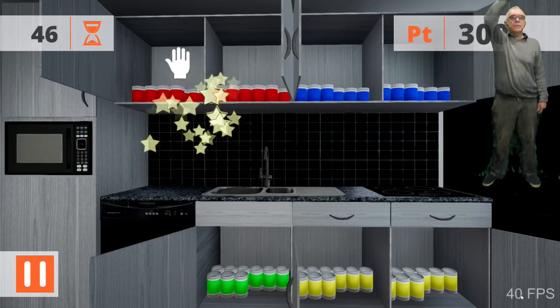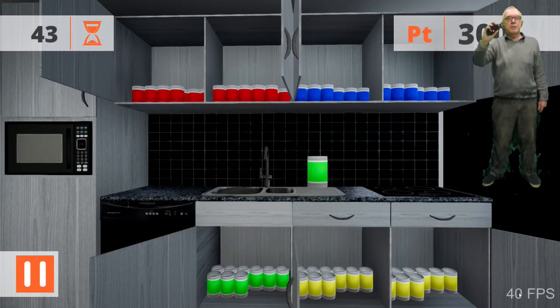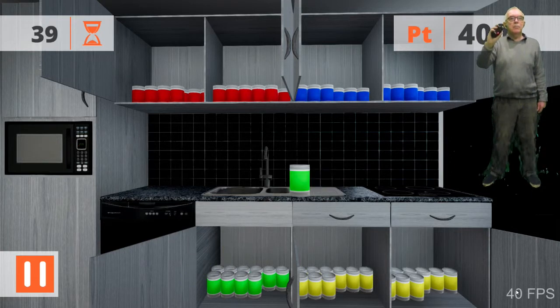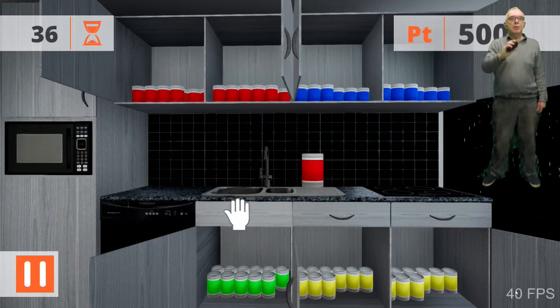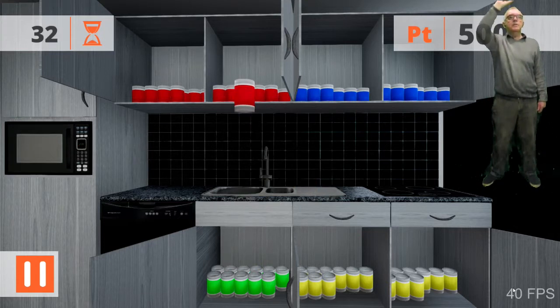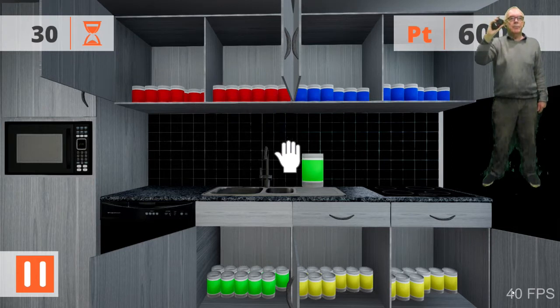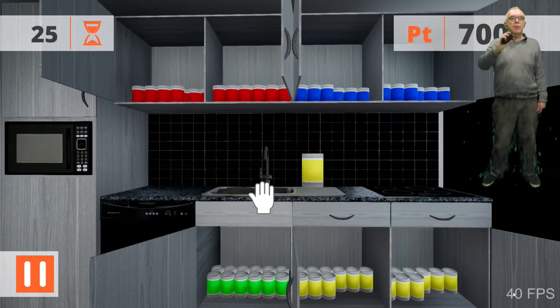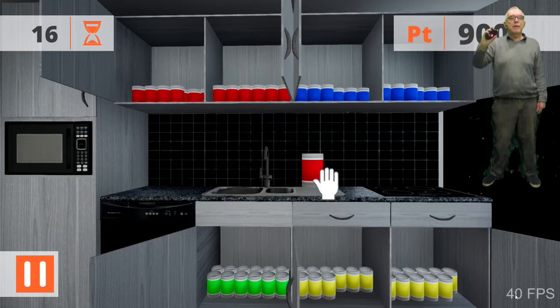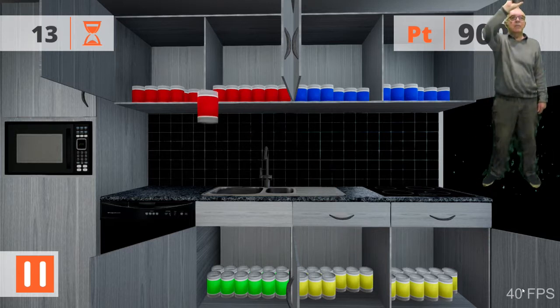And with practice, you can get quite quick at this. Green can goes down there. So it's testing not only your physical movement, but also some of your reaction times and your cognitive capabilities. If you're working with patients who have restricted mobility, you do have the option to be able to calibrate the system so that it makes allowances for the freedom of movement and the capabilities of the individual patient.